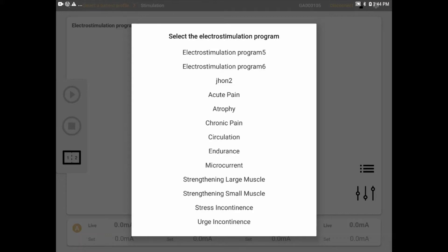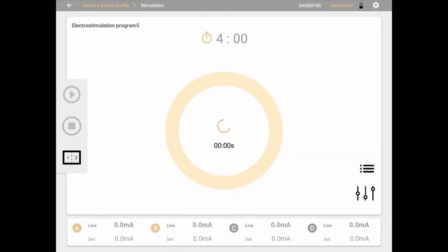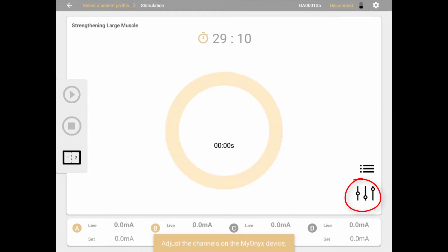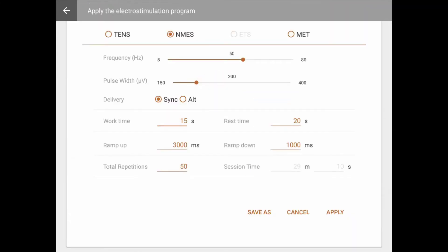When operating electrostimulation using the app, you can adjust some waveform properties. Click the dial icon on the bottom right of your screen. In this screen, you can set the frequency and pulse width values and adjust the session duration, timings, and phases.